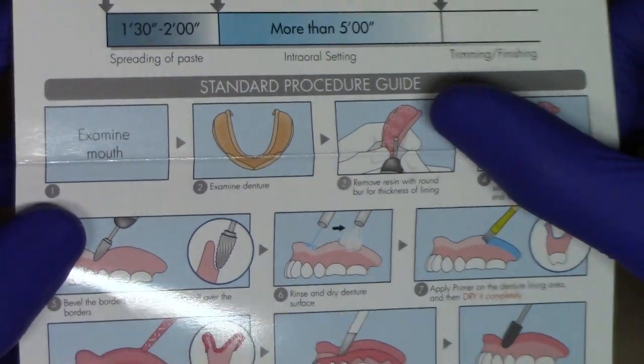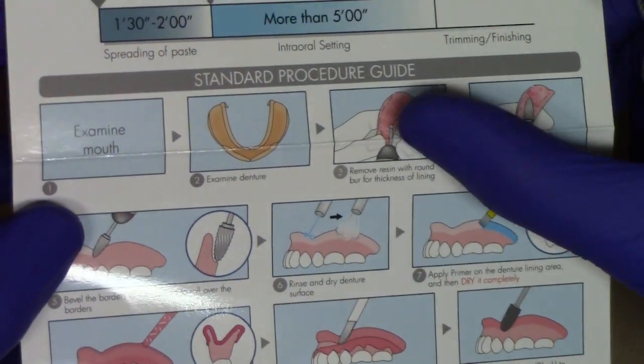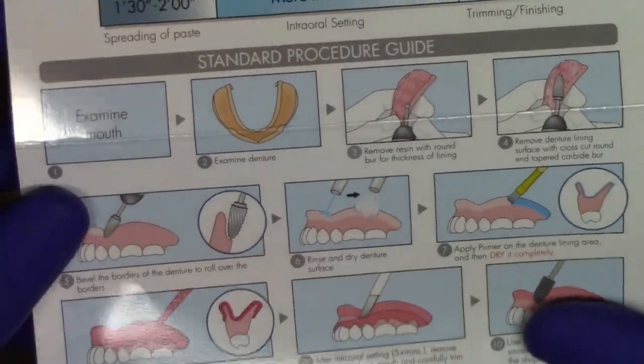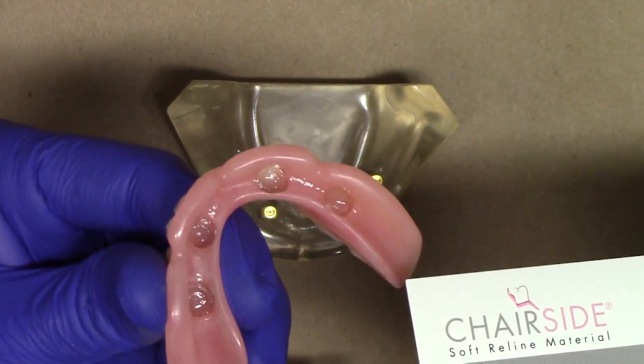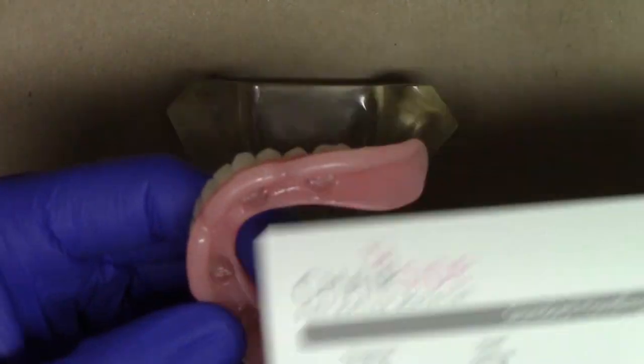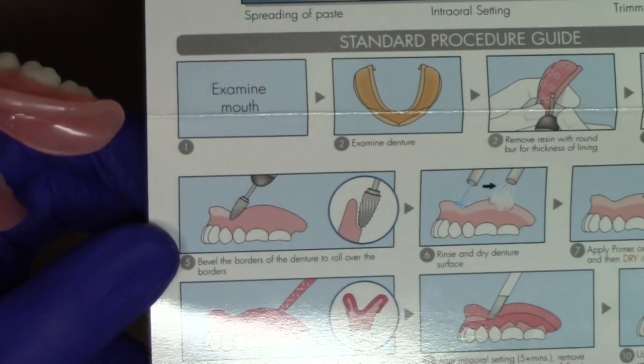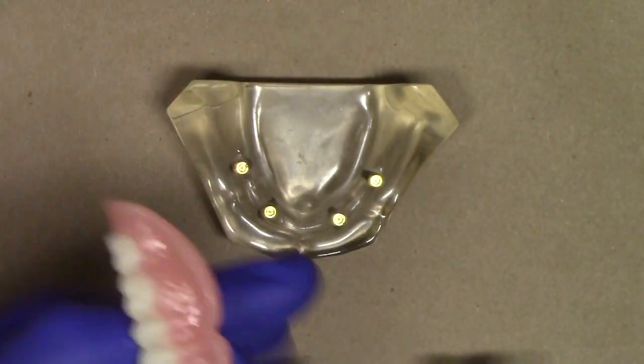And sometimes what I like to do also is use some round burrs on the inside of the denture as well, just to aid in mechanical retention. However, it's not critical. Assuming that you have these recesses in this position, most clinicians are just going to reline with the soft reline just over this. However, it is important to bevel these borders, which I'm going to show you right now.